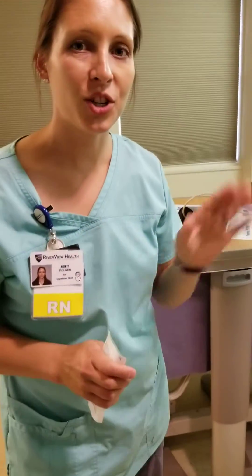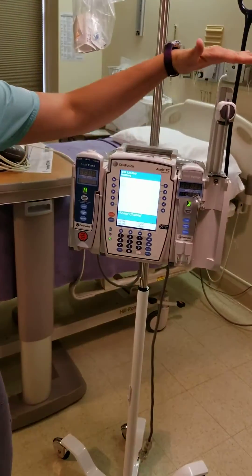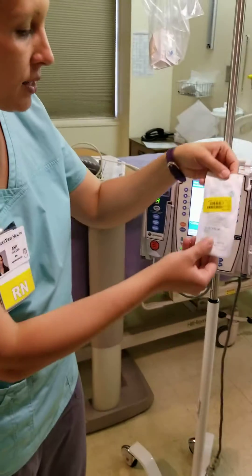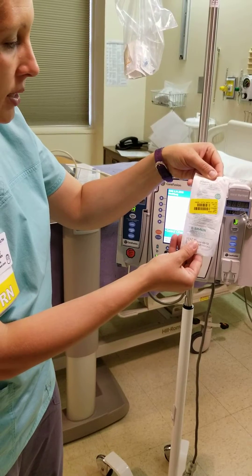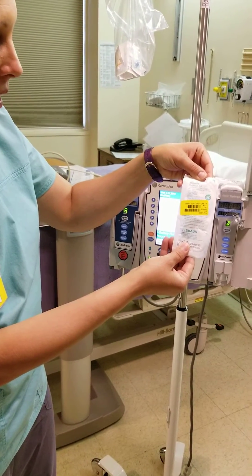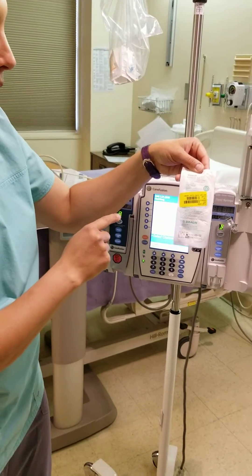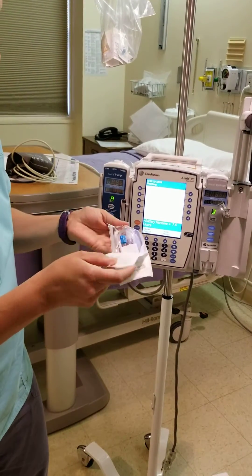Hello everybody. I'm going to show you how to set up and program our new syringe pump. We have these new tubings — it's the micro-bore extension set. They are located next to our PCA tubing in the main nurses station. So open that up.